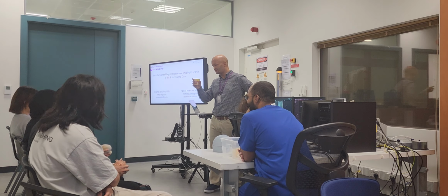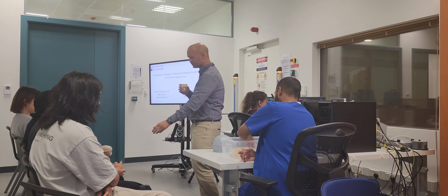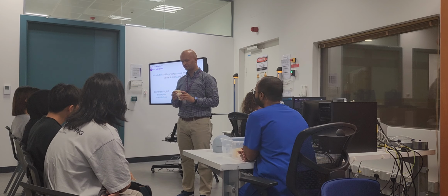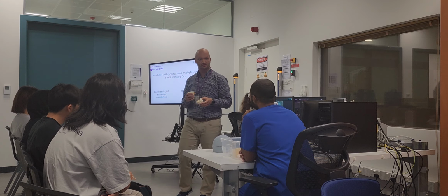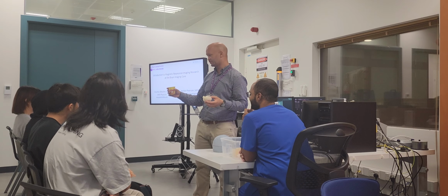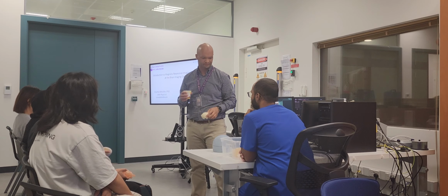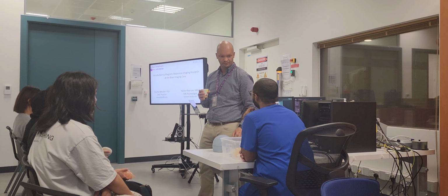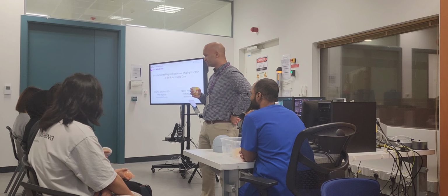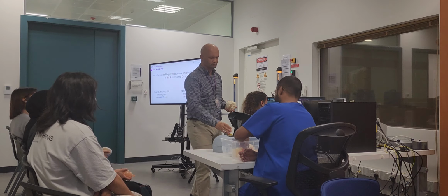And there's no cerebellum in that. If you look at the bottom, there is a cerebellum in the brain. So the model in your hand is missing the cerebellum and the subcortex. Really missing? Well, it's digitally missing. Physically, you don't see it, but we did digital changes. It's possible to remove digitally any part of the brain you're looking at. So what I removed on this side, we'll talk about it.